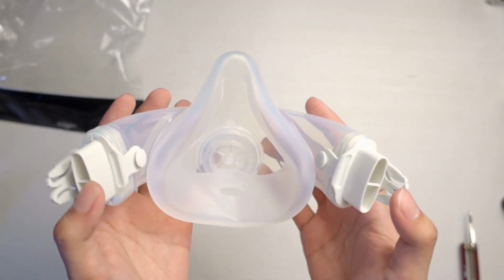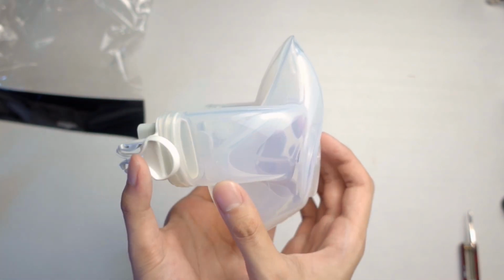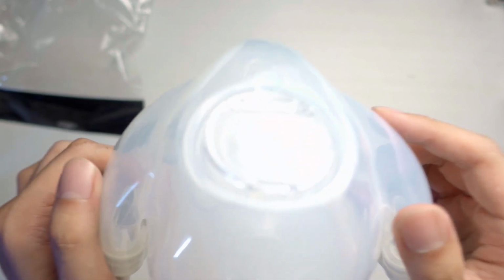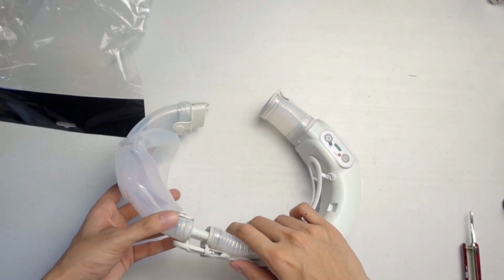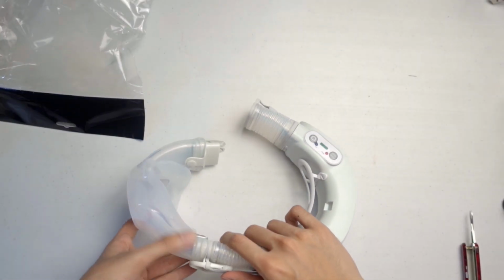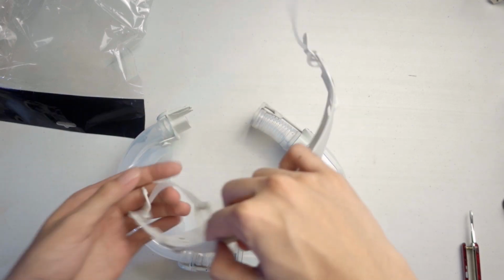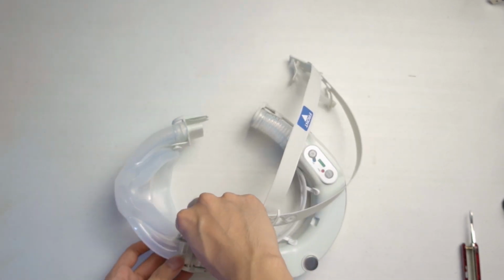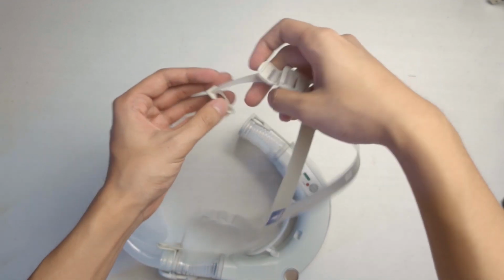Now going back to the half mask, this is the part that goes over your mouth. This is the side with the clip. This is the front with the exhalation valve. Now you attach the mask by clipping it into both sides of the blower. The harness is also attached on both sides of the mask. Use the arrow on top of the harness to orient it properly.